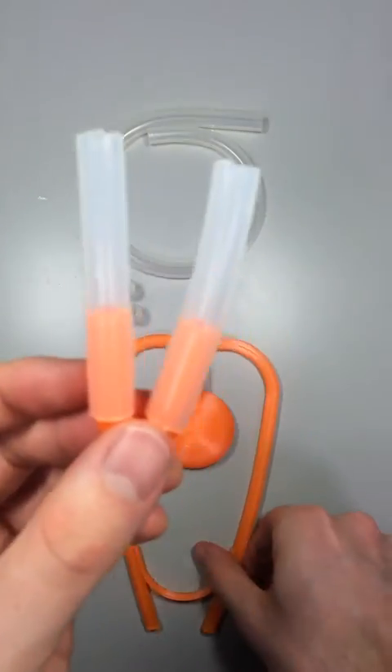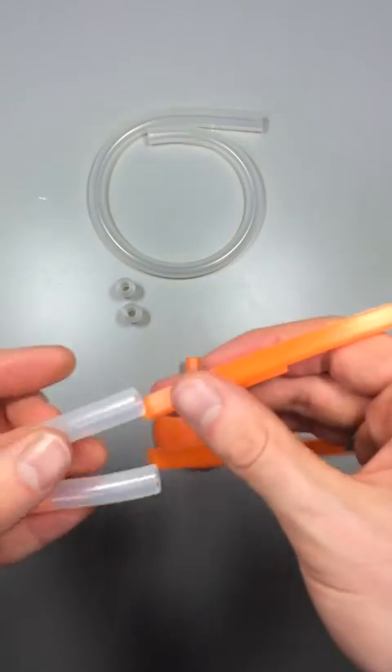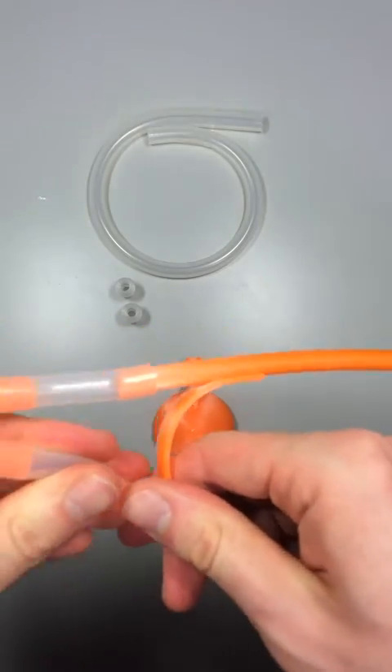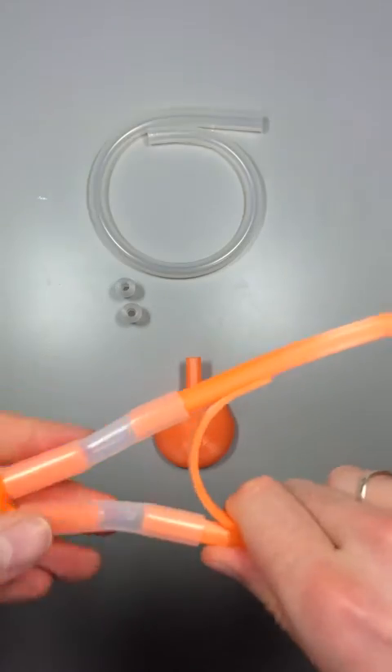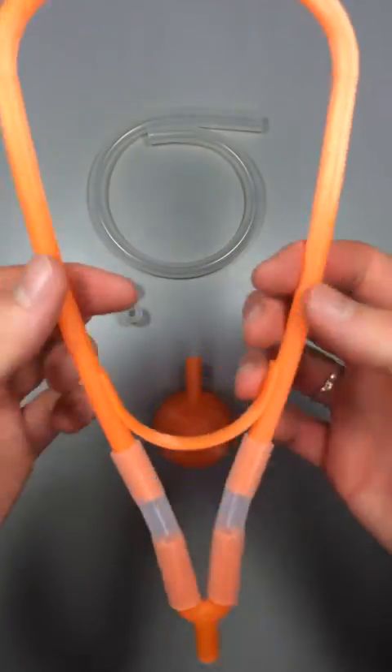Then once you've got that done, you can take your ear tubes and slide these on here as well — like so. Kind of even them up so they're about the same, and there you have it.